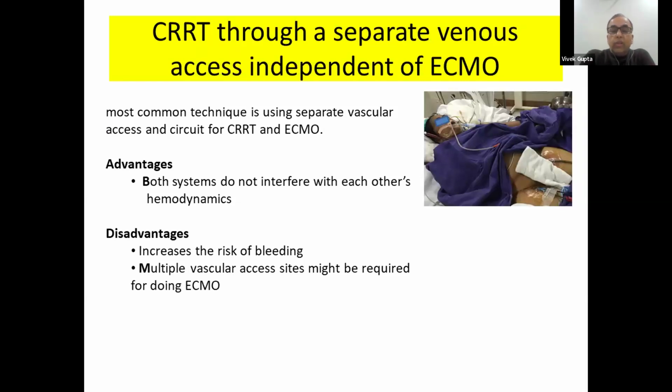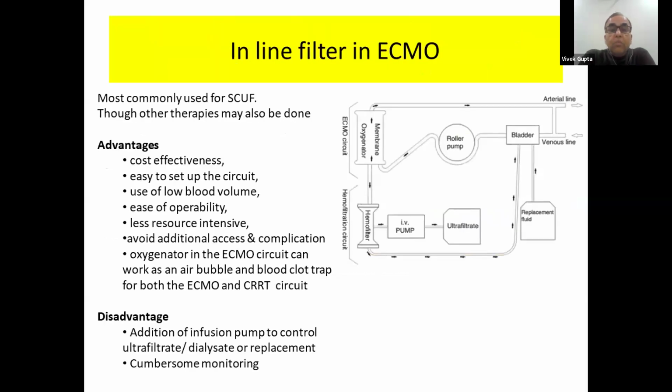Advantages, there is no interference with both the system related with the hemodynamic of the therapies. You just place a dialysis cannula separately and you initiate CRT separately. But the disadvantages, because patient is on heparin, so more risk of bleeding, and you are losing one venous access, which may be required during an ECMO run for the access if the less flow is there in the ECMO and you want to put another cannula. Otherwise, it's separate, probably it's a good one.